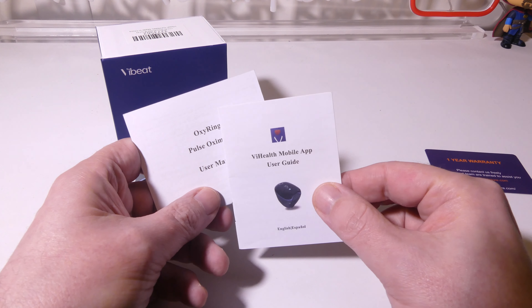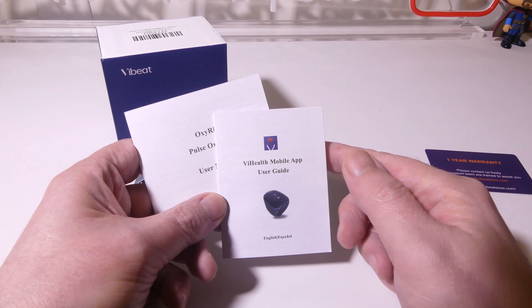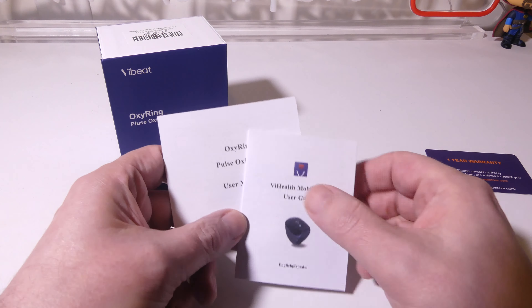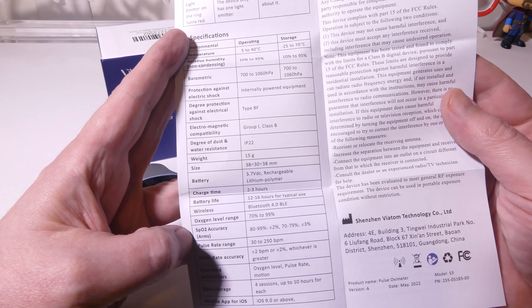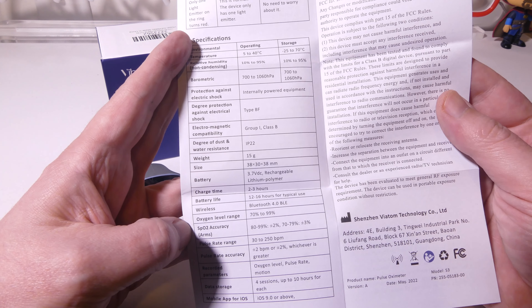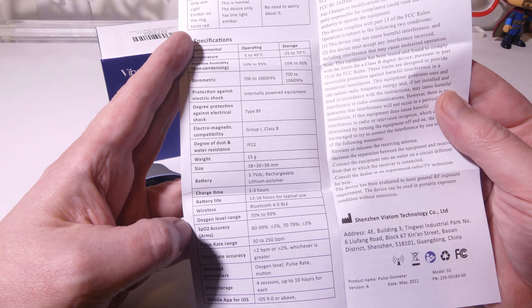So this is everything that you get once you get the OxyRing out of the box. Of course, you're going to get the main unit itself and you're going to get a little bit of documentation here as well. You do get a warranty card. You do get a user guide for the VHealth mobile app, which is available on iOS and on Android. This is going to be in English and I believe in Spanish as well. But that is the app that you will use to connect the device to your phone or tablet, whatever you're going to be monitoring on.